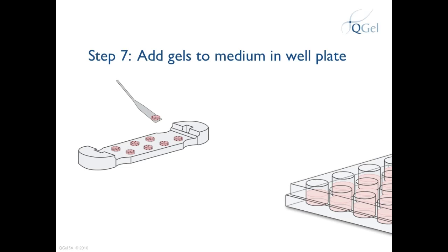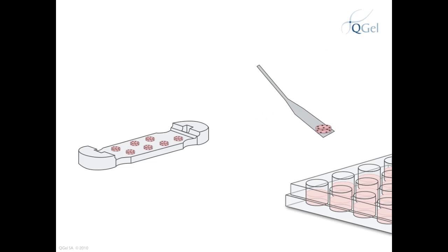Prepare your well plate and place each gel into each well of your well plate, containing 1 ml of pre-warmed culture medium of your choice. We suggest that you replace the medium subsequently after 2 hours incubation. Thereafter, replace the medium according to your normal experimental conditions.